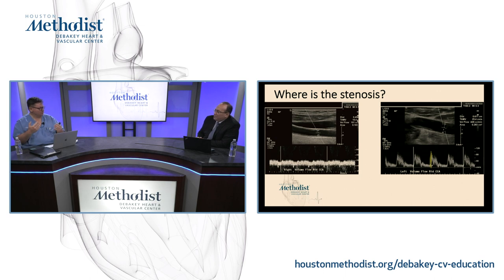The blood pressure, I wanted to give a clue. So the blood pressure difference would give you a clue as to why this is an innominate versus a... We received the first answer, and again, we are giving you a clue that this is not a brachiocephalic or innominate stenosis, because your blood pressure difference points out that your left side blood pressure is lower. So if you have a brachiocephalic or more proximal stenosis, then your right side blood pressure will be lower.